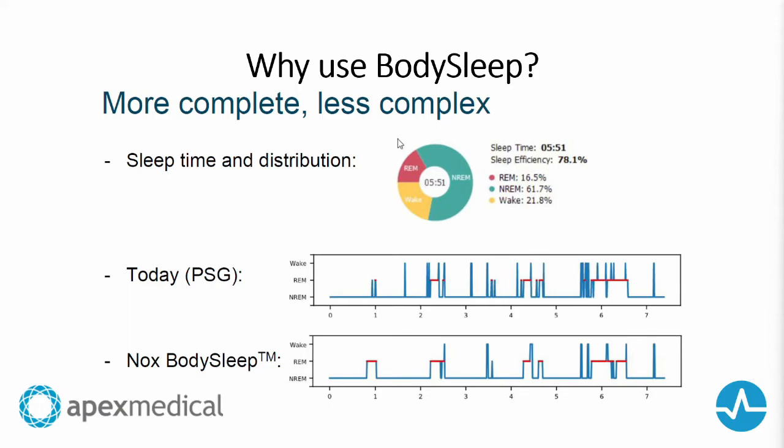This diagram shows how BodySleep compares to traditionally scored PSG derived sleep stages. The figures are taken from the poster presented at World Sleep 2019, and I'll provide references at the end for your interest.